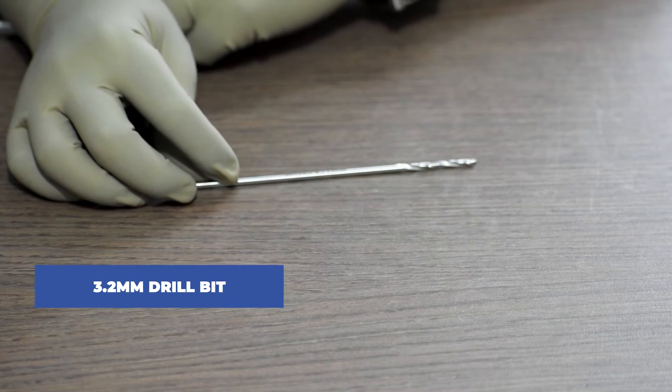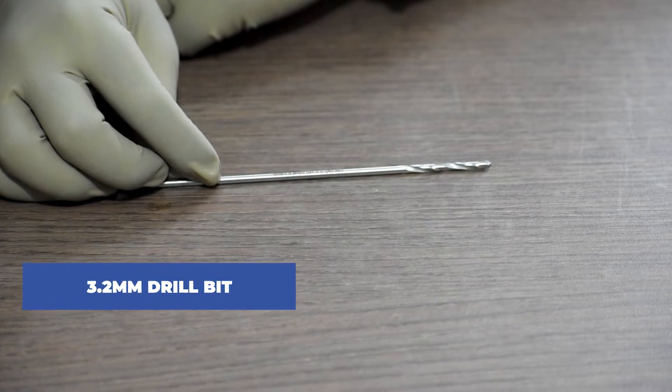And lastly, 3.2mm solid drill bit. Now, let us understand the process of fixing a 6.5mm cannulated cancellous screw.